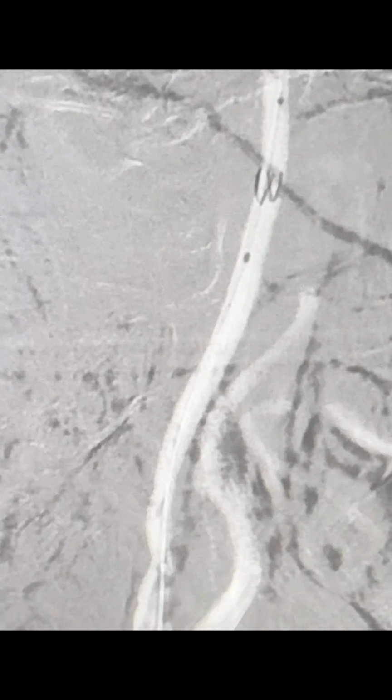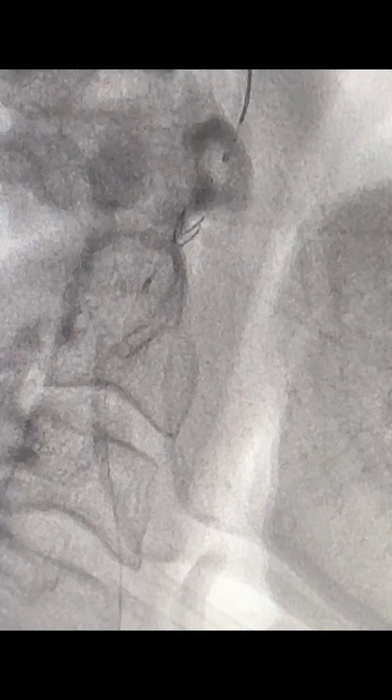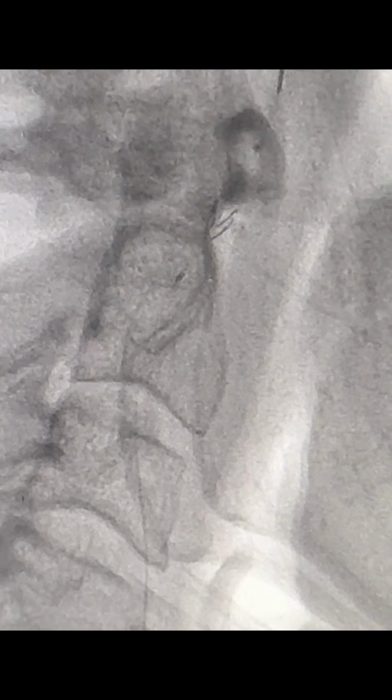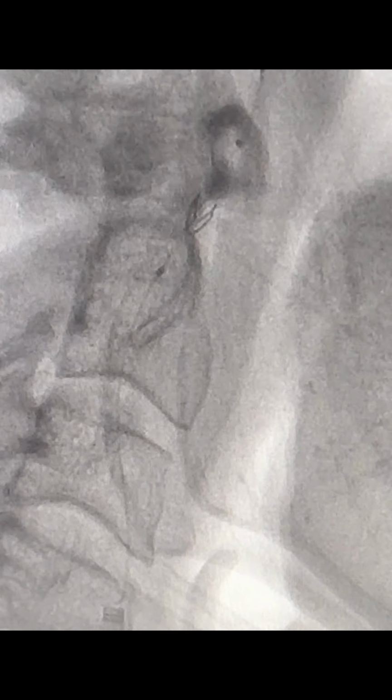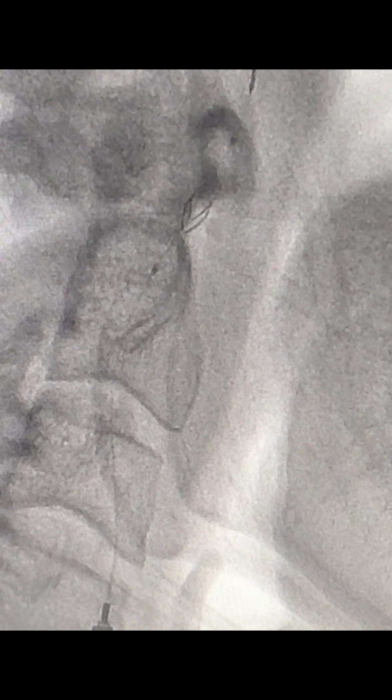Since the lesion is already dilated, with the same embolic protection delivery wire, we can take the stent. So now we are crossing the lesion. We are taking the carotid stent through the guide catheter over the same microwire of this distal protection device. This is how we are delivering the stent. The stent is 8 into 7, 8 into 6, 30 millimeter carotid stent.